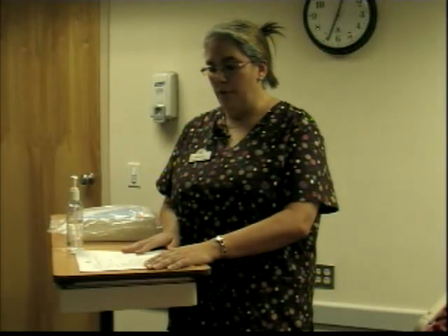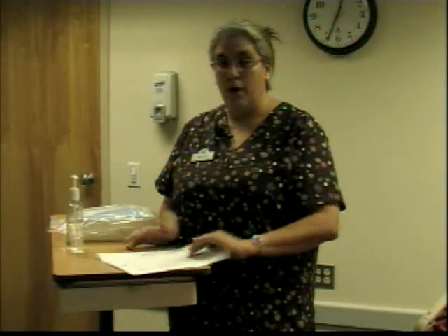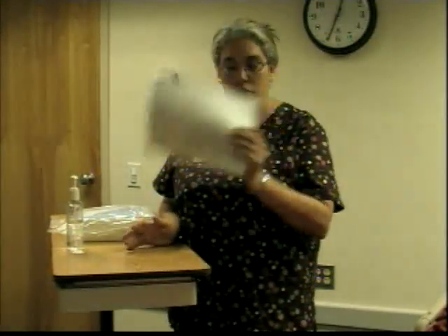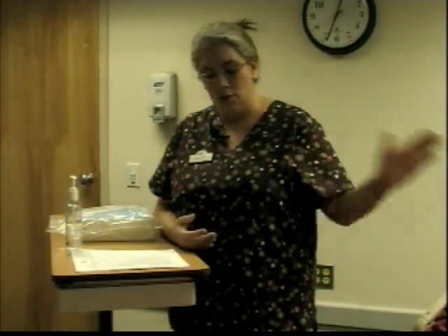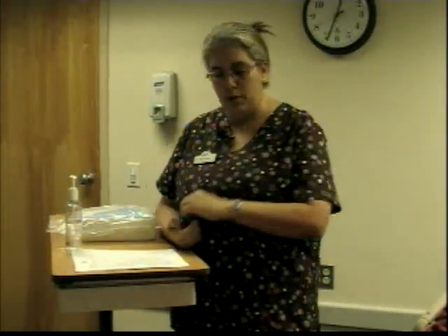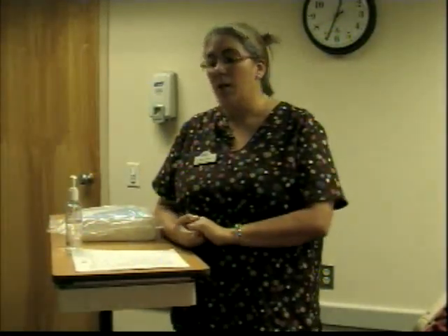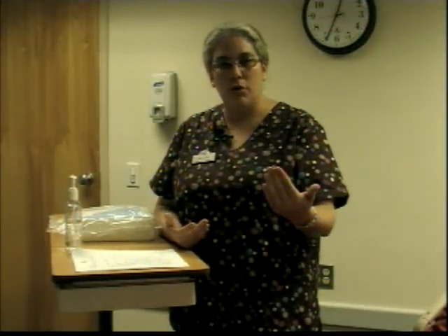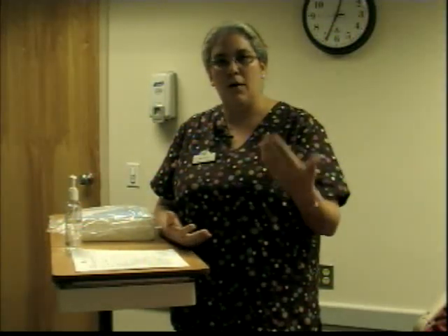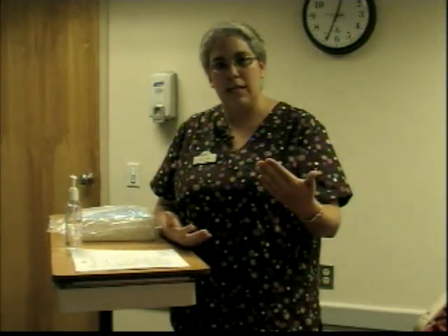A few things to remember before we begin: one, we have a checklist on WebCT so you can see all the key points and follow through with the demonstration. Two is going through the nursing process and how you gather assessment data.